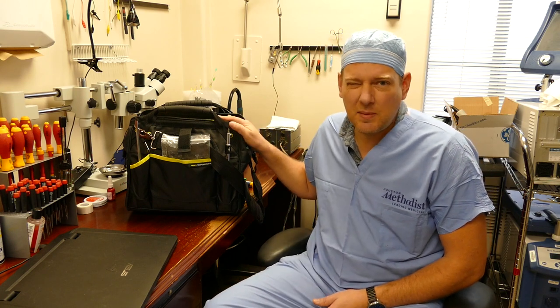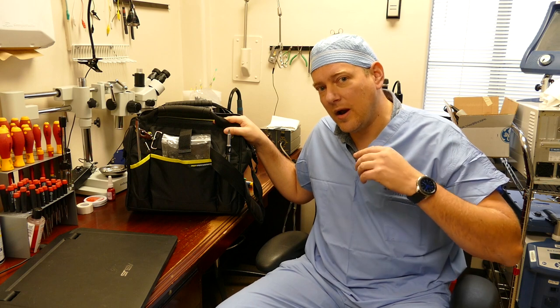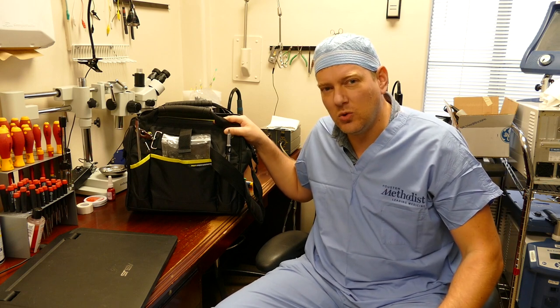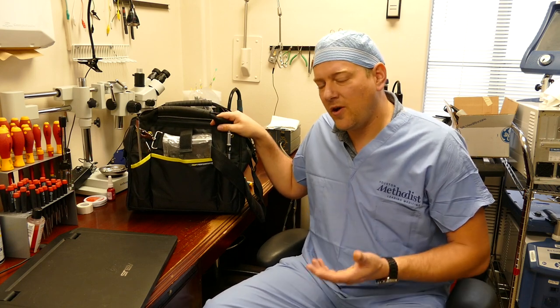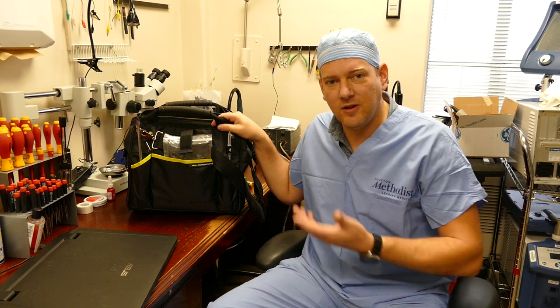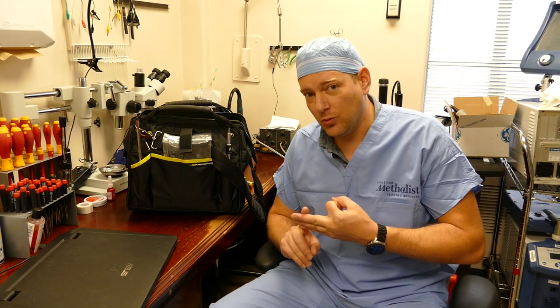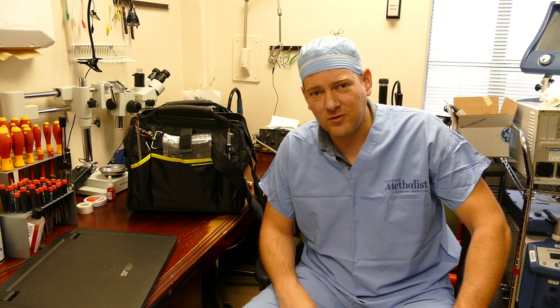Hi everyone, welcome back to A Better Biomed. Today I'm going to go over the top 10 tools I use when I'm out in the field. This is my tool bag, and one of the things we always have to consider when doing work orders is the weight of our tool bag. It gets pretty heavy quickly because it's got a lot of space, but that space doesn't all have to be filled. A 60-pound tool bag would be an absolute bear to lug around between departments in a large facility. So we have to make sure our tools are effective, multi-purpose, and really good quality to hold up in a commercial setting. Anything to get the job done as quickly and as professionally as possible.